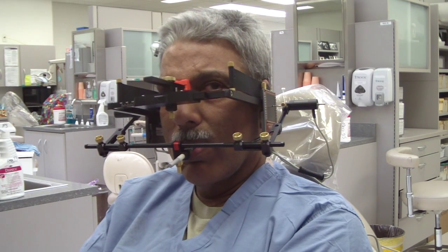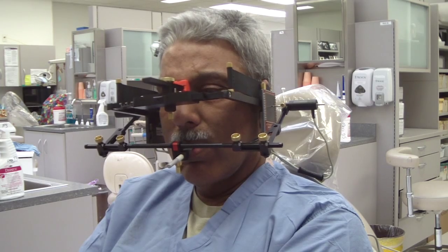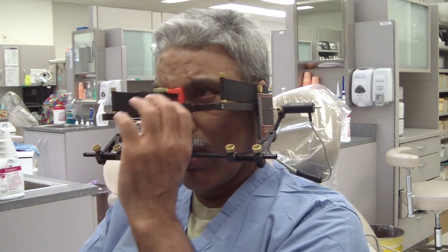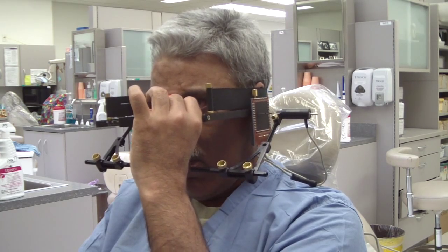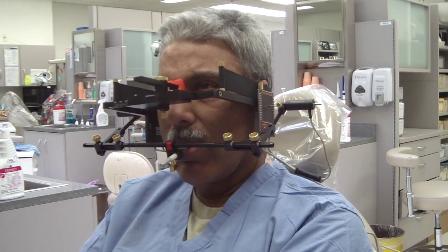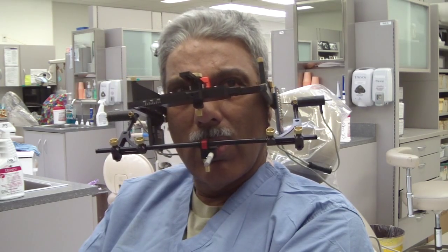We found that out just doing this now — the errors we introduced already just by putting it on. Is that significant? I think it's significant when it comes to doing a full mouth restoration, increasing the vertical dimension of occlusion, or restoring the vertical.